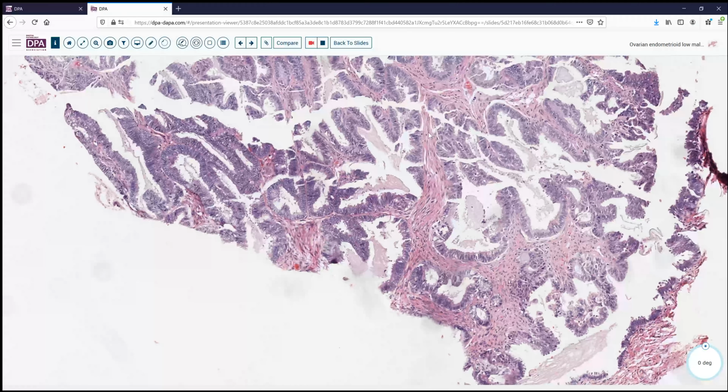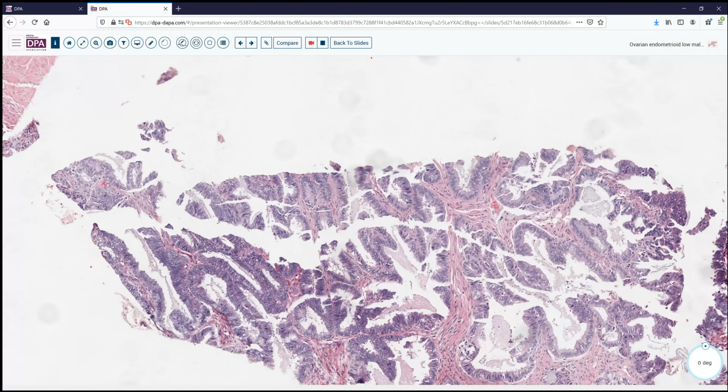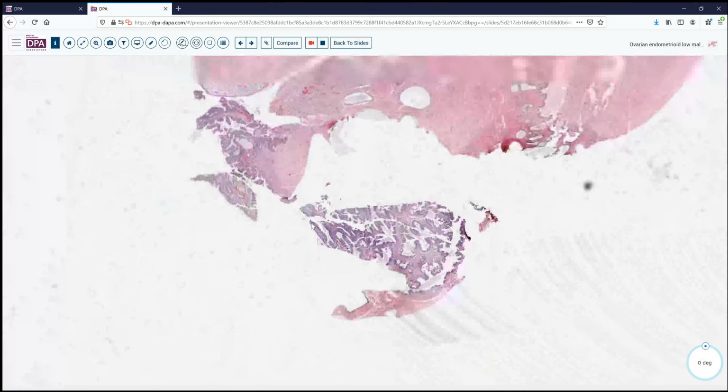And why is this not atypical hyperplasia? Well, in endometriosis, the stroma would be an endometriotic stroma, but here it is not. So this is occurring in an adenofibroma background, and we're getting atypical hyperplasia type of changes, glandular crowding, a little bit of columnar cell change. But again, we're not having the necrosis or rounding up of the nuclei into more carcinomatous features.